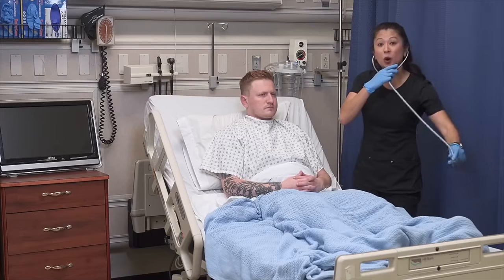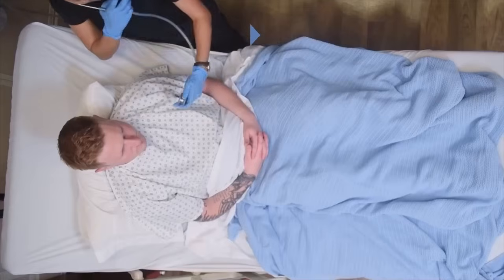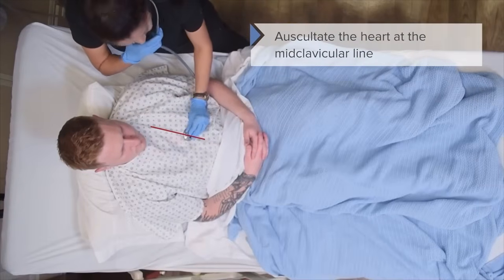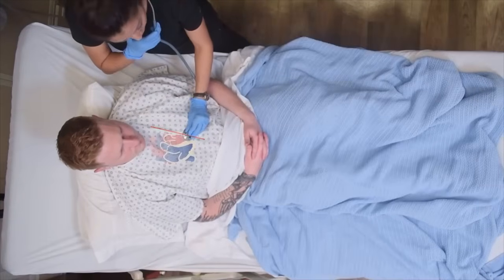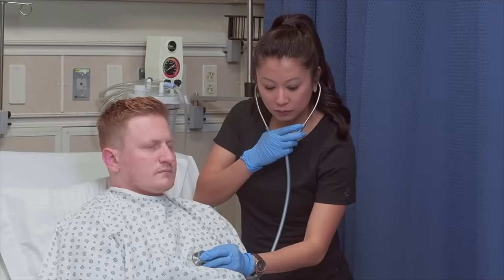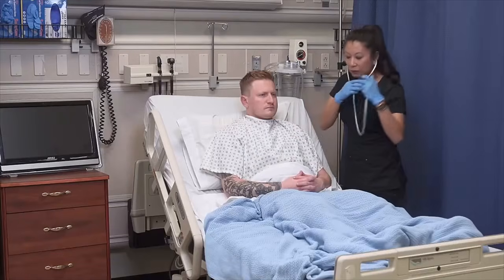I want to listen for what we call S1, S2, or that lub-dub, lub-dub. When I listen, I'm just going to split about the mid-clavicular line and take a listen to Brandon. Okay, perfect.